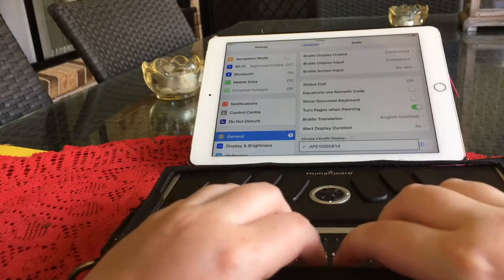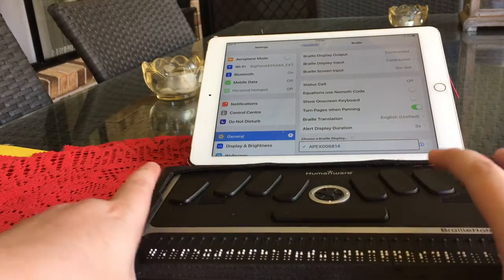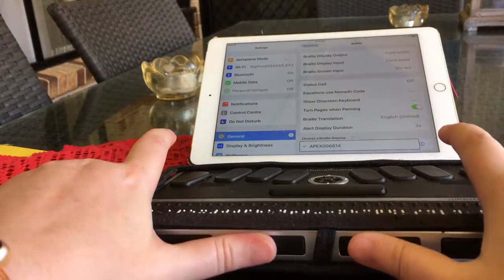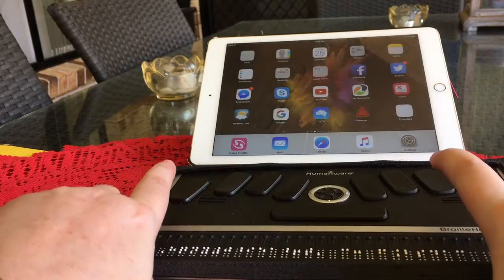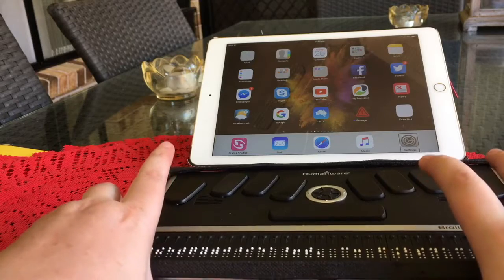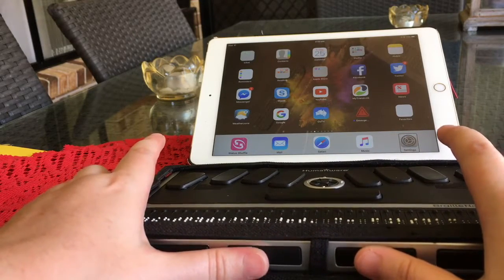I'm going to start with the equivalent to the Home key. On a BT keyboard it's your thumb keys — your two inner thumb keys, the two middle ones — press them at the same time. And we are back at home. Same thing with your app switcher — we'll be pressing it twice real quick.